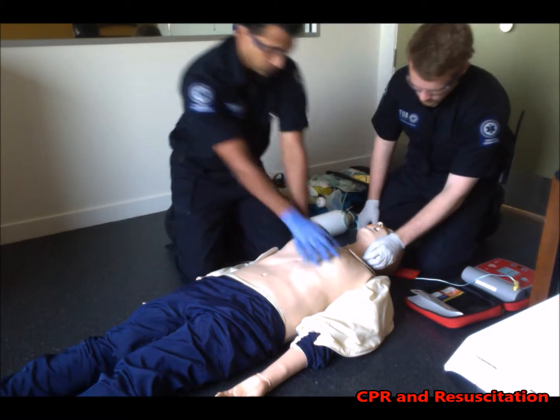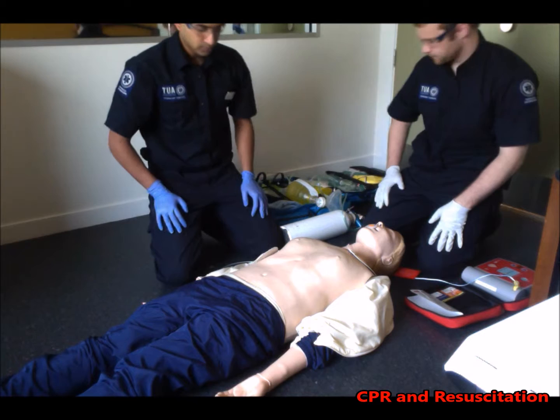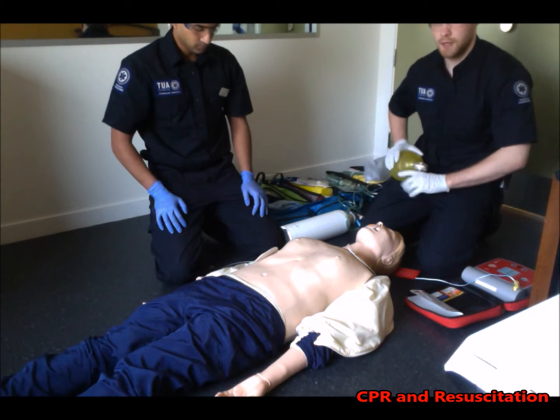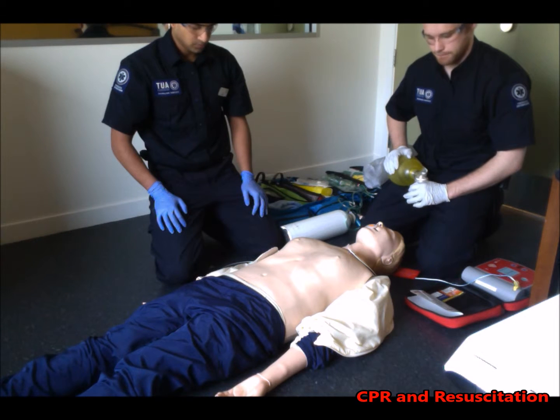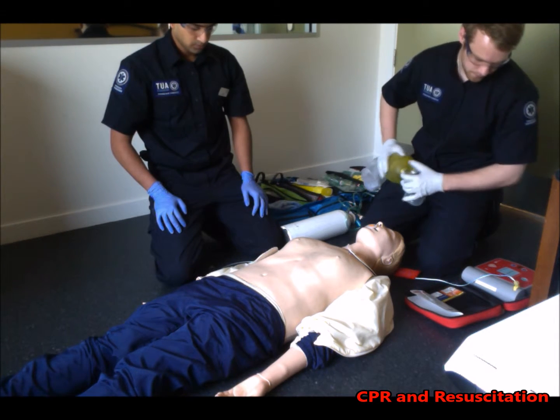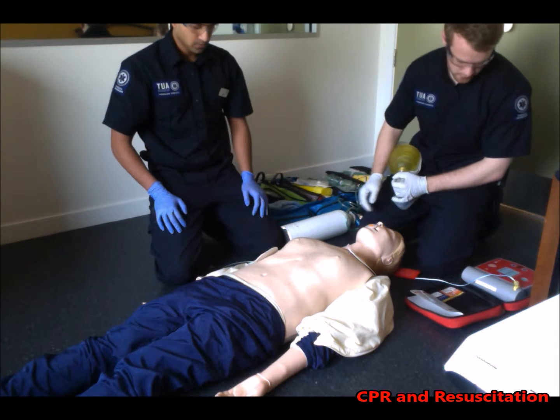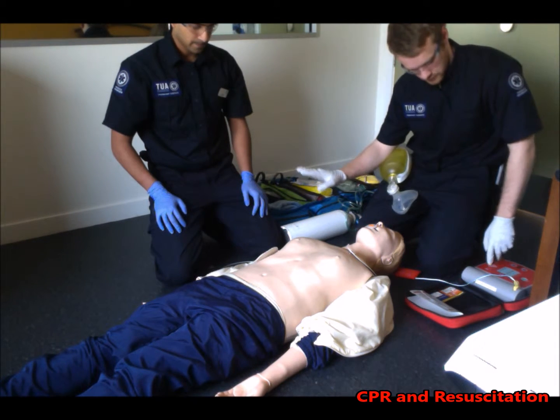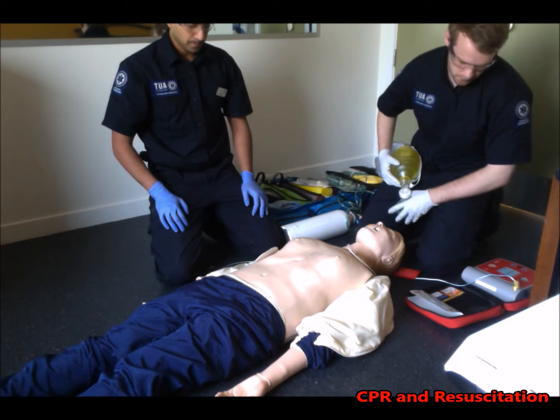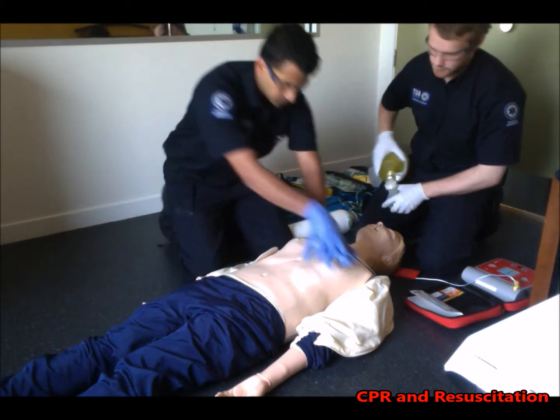Analyzing heart rhythm. Do not touch the patient. Shock advised. So let the AED charge. Stay clear of patient. Deliver shock now. Red shock so delivered. Stay clear. Paused. Start CPR.